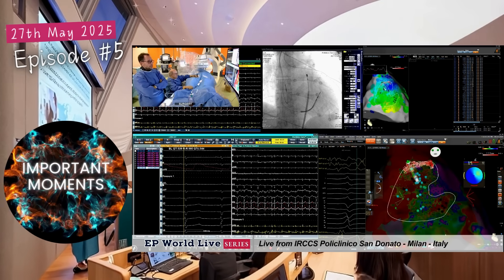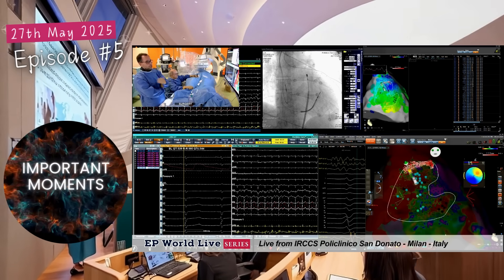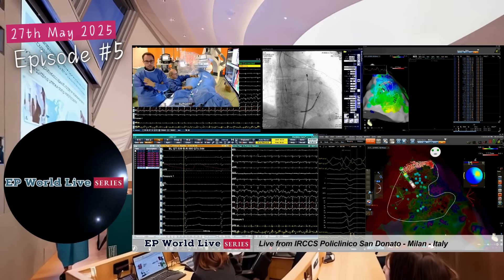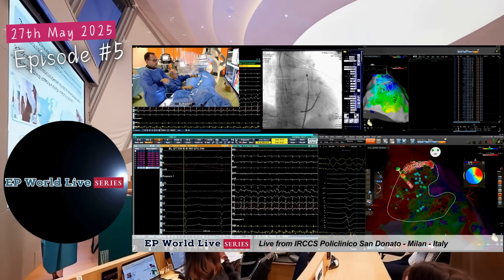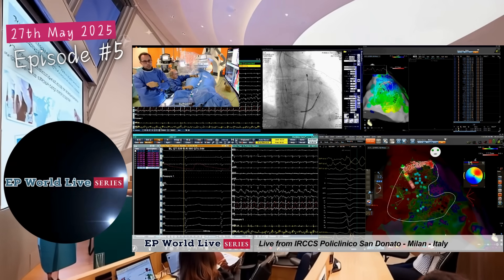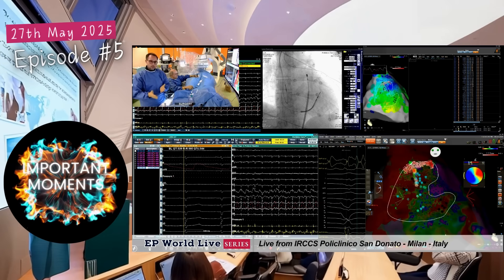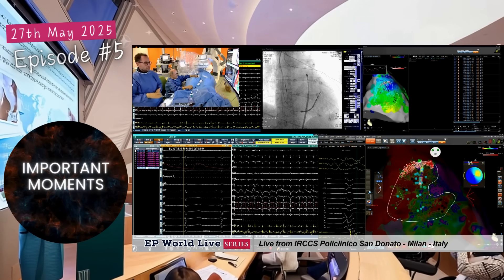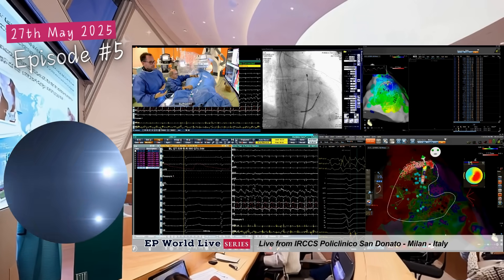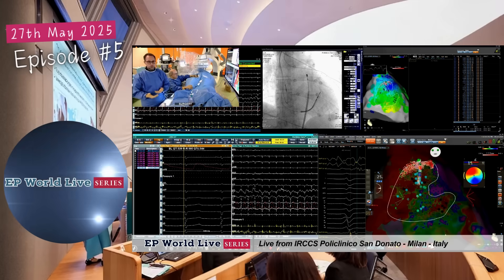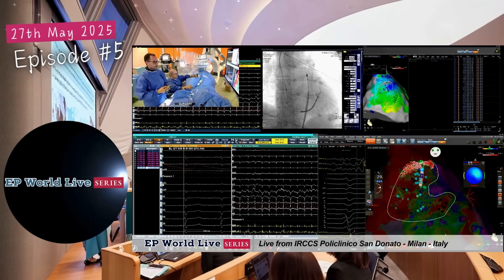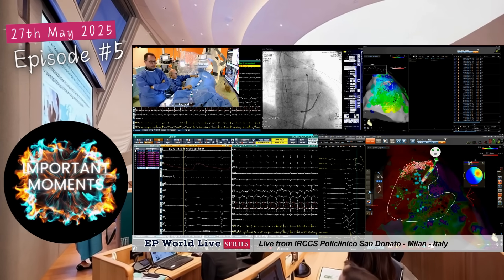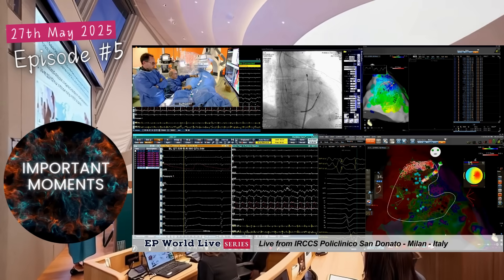As you can see here, the bull's eye is blinking in red, meaning that the temperature at the level of transition — at the contact between the catheter and tissue — is increasing. And this is important to achieve adequate radiofrequency delivery in this region.